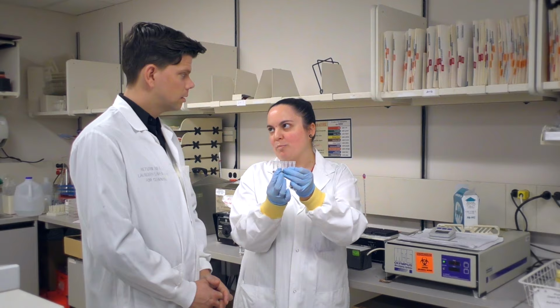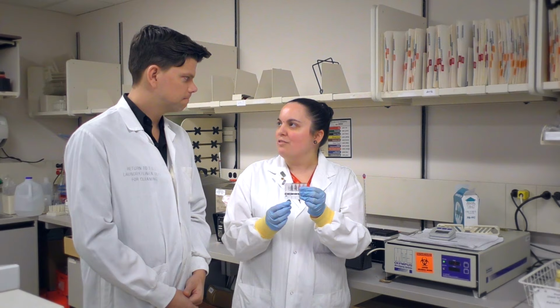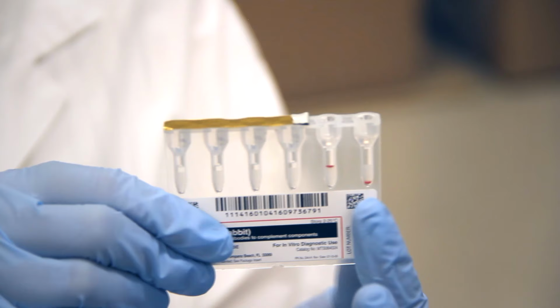And you can give the negative one. We can give the negative one because it is compatible. And it'll work fine. It'll work wonders. That's all that matters. That's right.